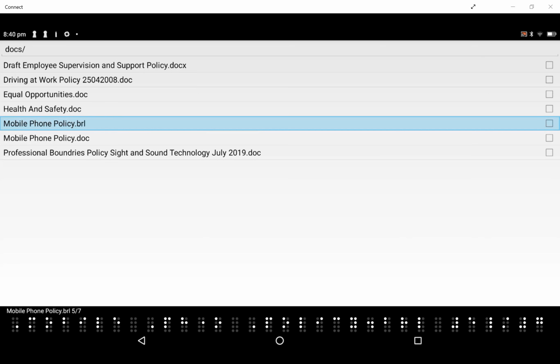So you can, for example, have address lists and fields and records and queries, do all that kind of stuff that you would do in a Microsoft Access database. But the other thing that's in that database folder is settings for things like your speech settings. There are files that are kept in there that the system uses.